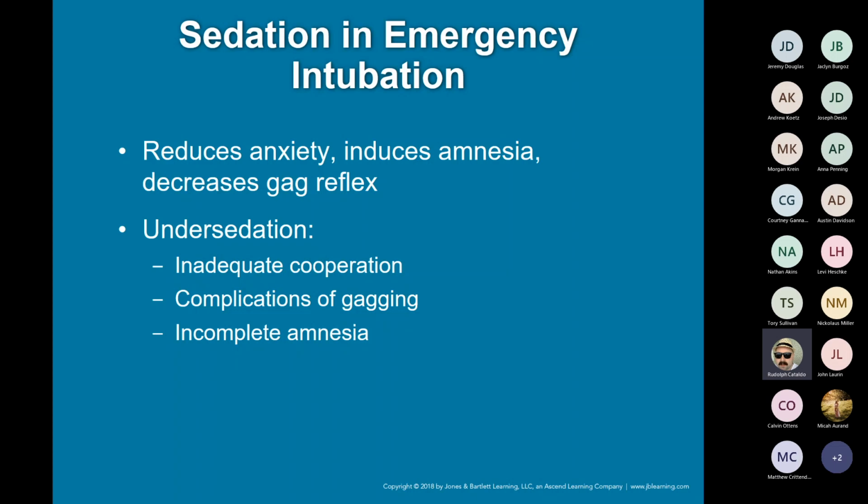Now, if you have a patient, and end-tidal is a great way to tell if a patient's starting to wake up out of sedation, because remember, instead of that nice square waveform, we might have a little hump in the middle of the square called a cleft. That could indicate that our patient is starting to come to. And that can happen 3 to 5 minutes before our patient fully wakes up. So that's a pretty good indicator that I might need to redose my patient with some sedation meds.